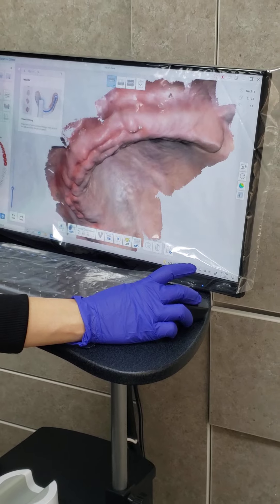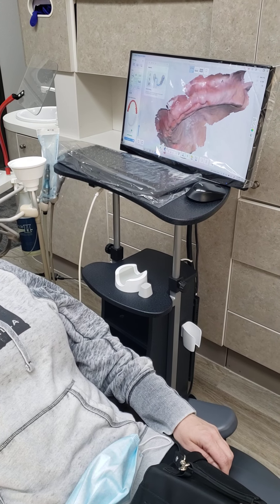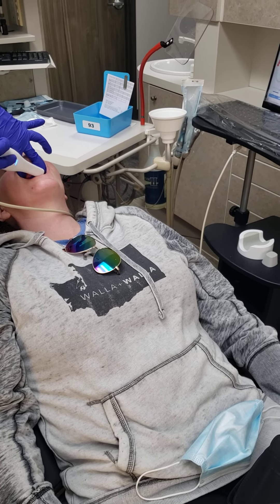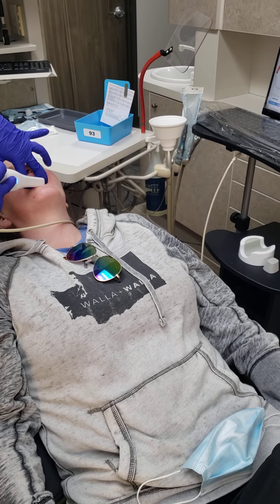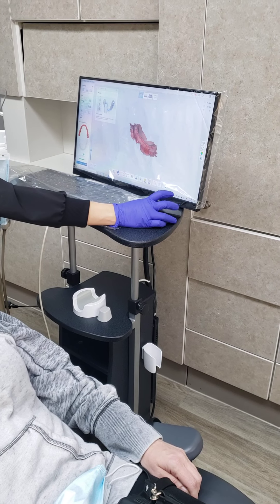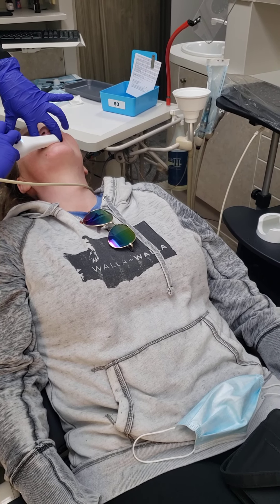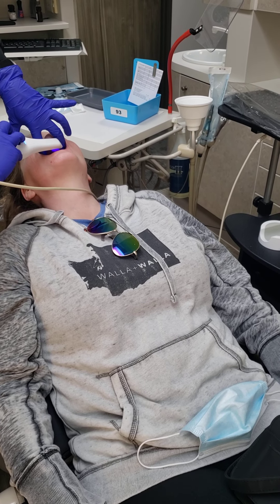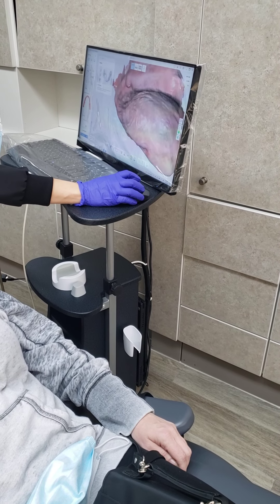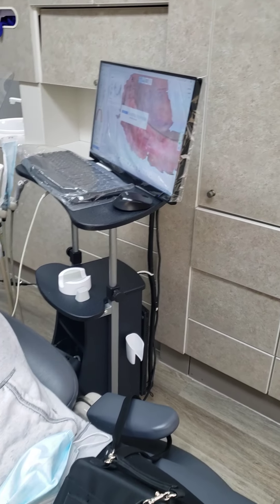Man, I was so expecting them to put that like putty in my mouth. I was all gearing up for it. Anytime I've ever done anything like that I've always gagged real bad. Yeah, I thought, oh no. So this is happening right? Oh yeah. Wow, that's amazing, that is amazing. I just need a little bit on the front and that's it. Wow, you see what I mean when I said they said I had that like high arch? Yeah.